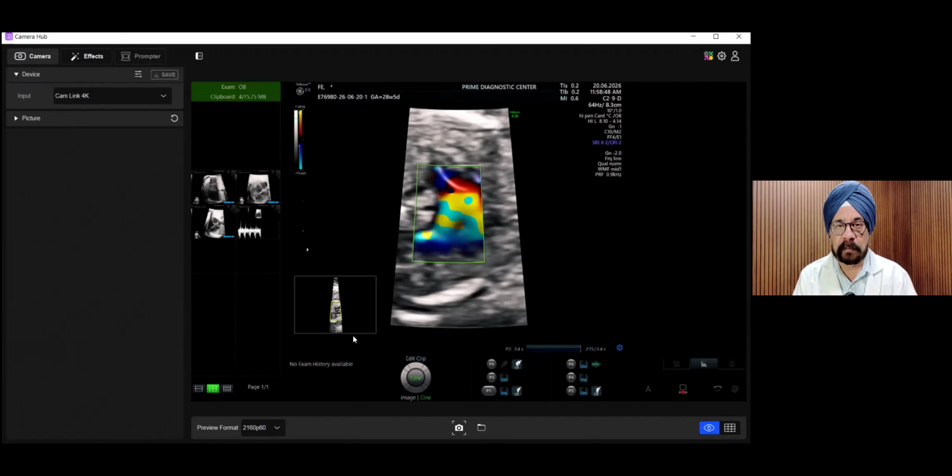You can have three pulmonary veins. You can have four pulmonary veins. You can have five pulmonary veins also. But these are normal variations, and our idea here is to rule out two most important things, and these are the veins we really look for. One is that we look for a single vein entering into the left atrium, and if it is there, at least it rules out TAPVC.